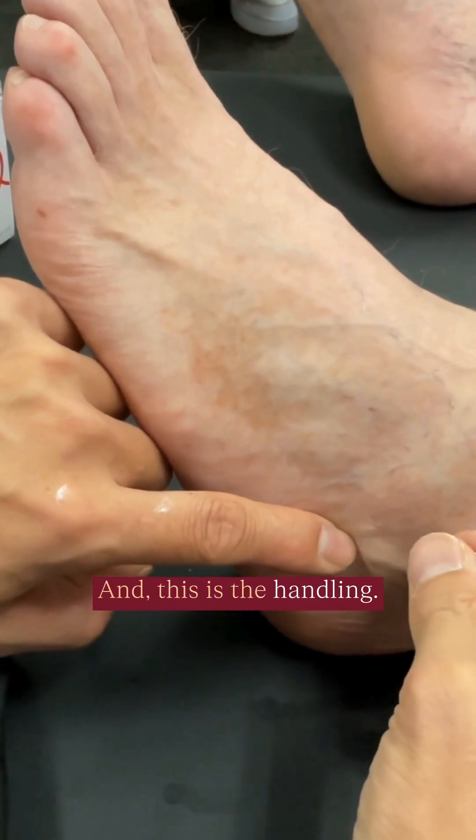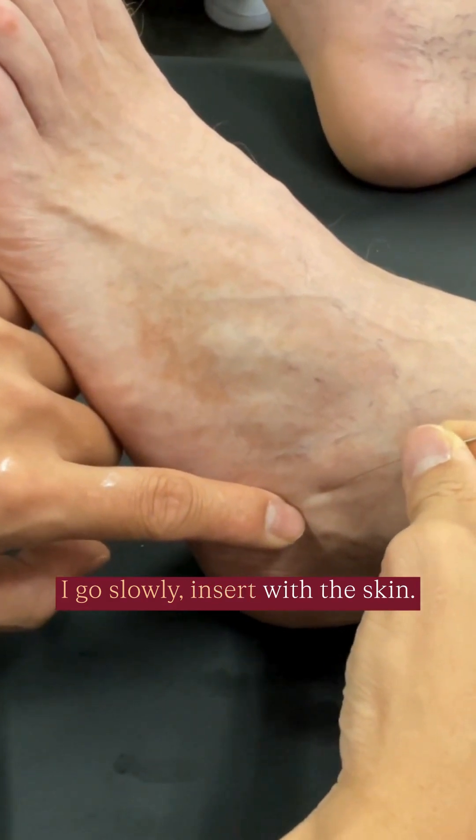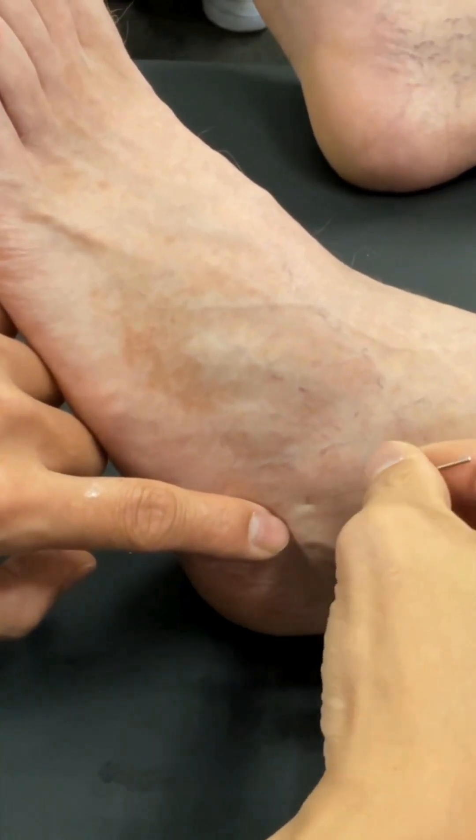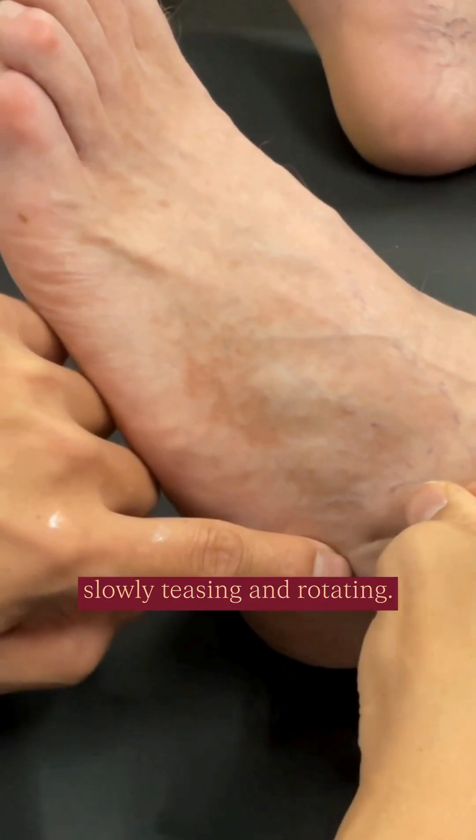And this is the handling. I go slowly, insert with the skin. I'm not pushing — I'm slowly teasing and rotating.